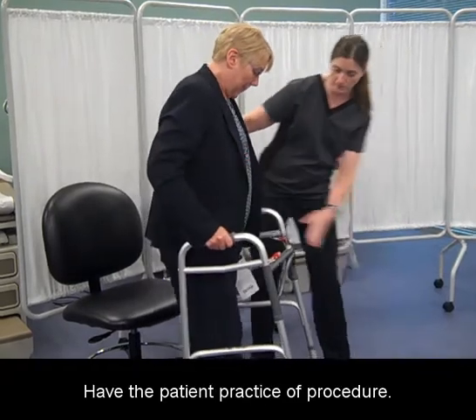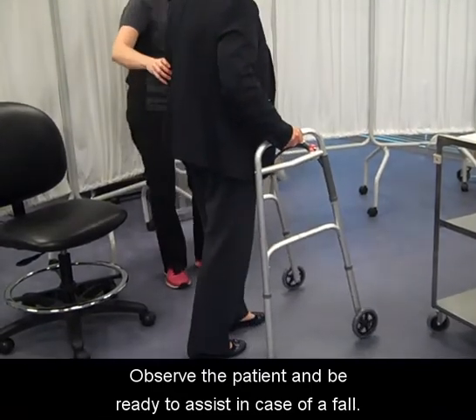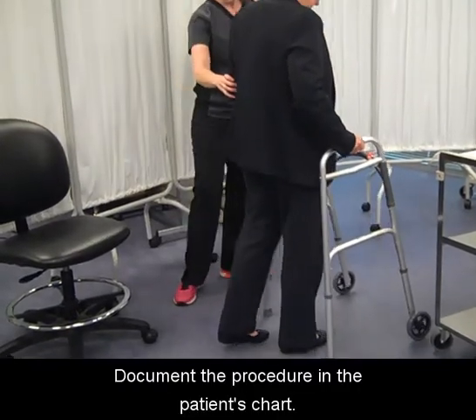Have the patient practice the procedure. Observe the patient and be ready to assist in case of a fall. Document the procedure in the patient's chart.